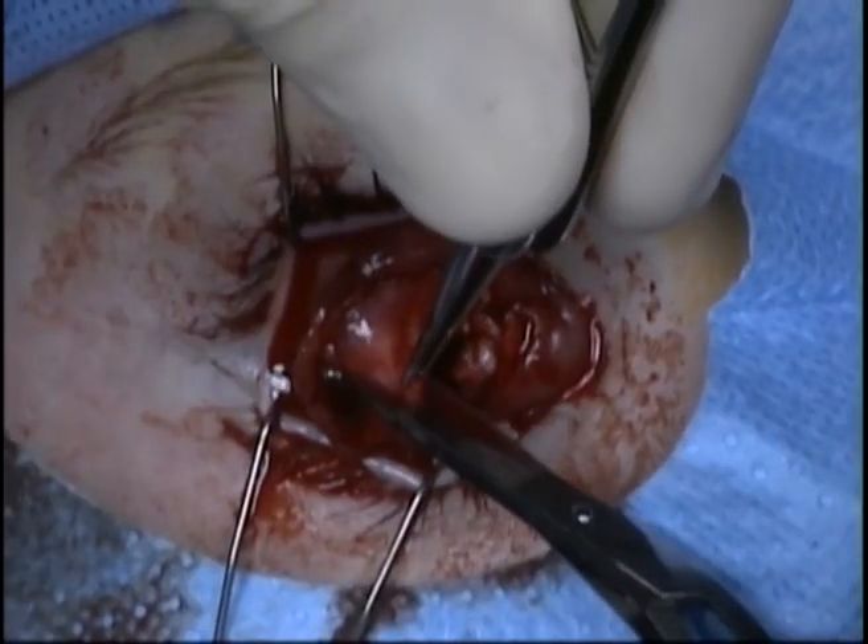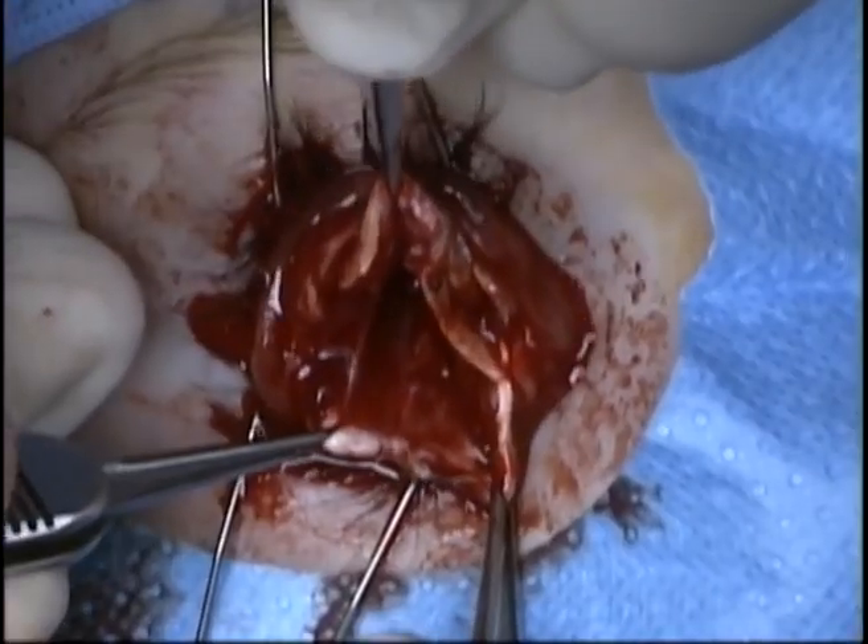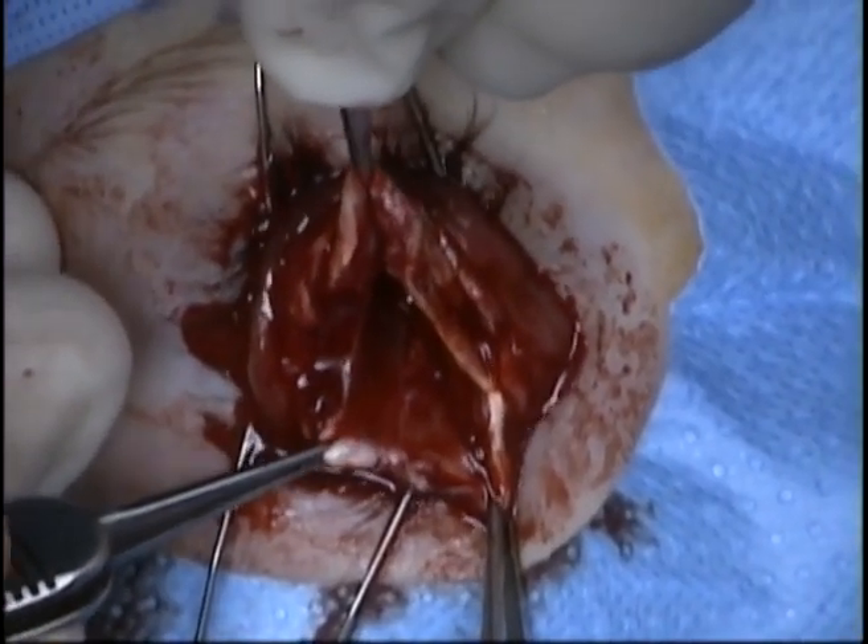The anterior sclera is then incised so that an implant can be placed. The intraconal space, posterior to the posterior sclera, is demonstrated.